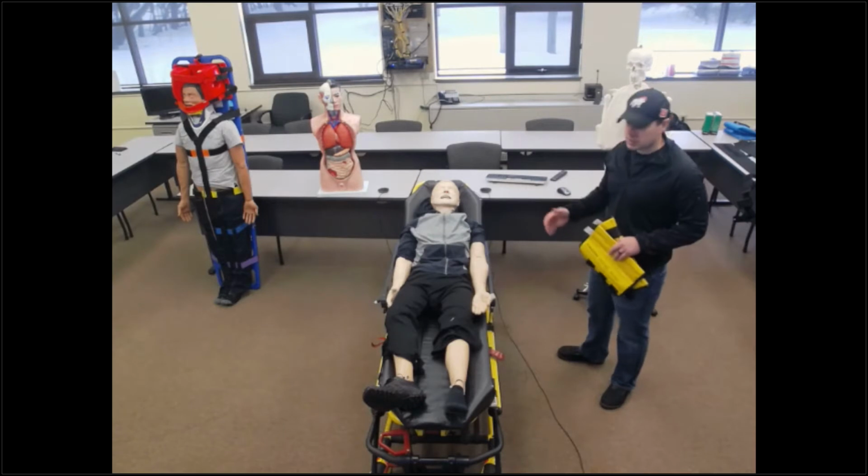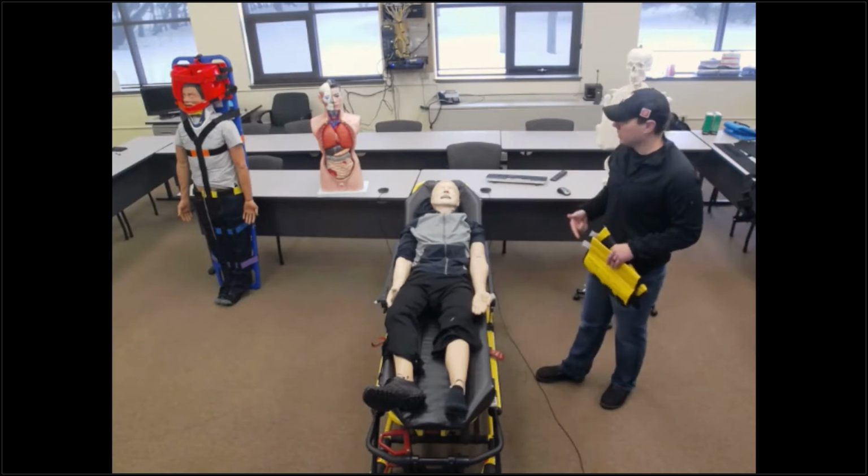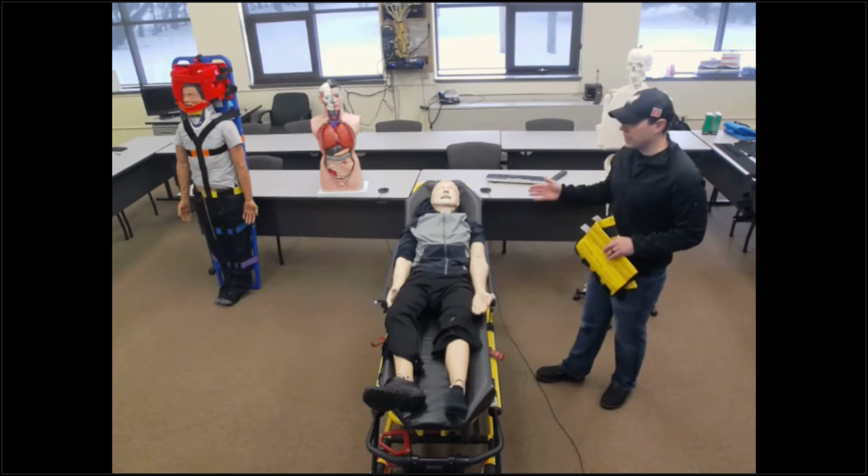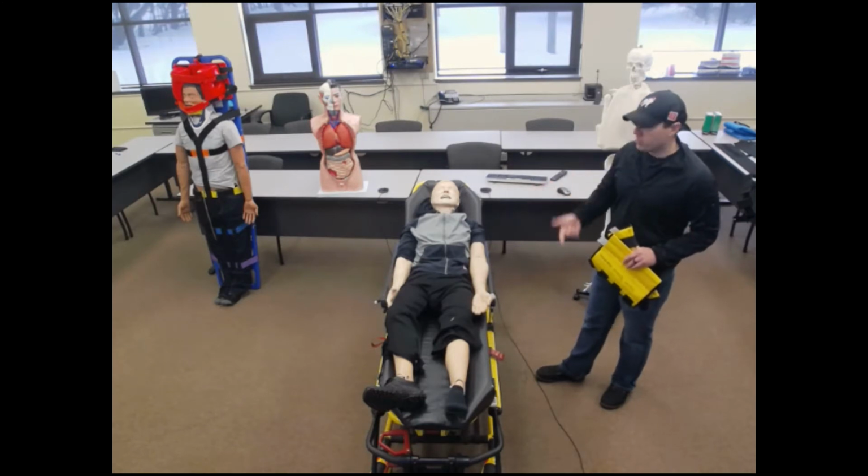I have conducted my general impression. My scene size up, the scene is safe. I got my BSI on. My patient's alert and oriented. Airway, breathing, circulation is proper and controlled.